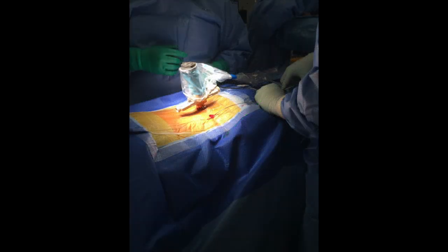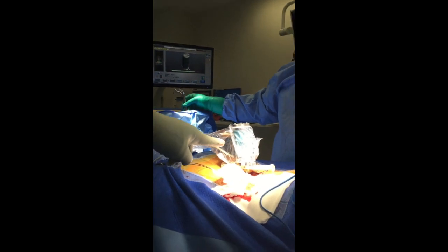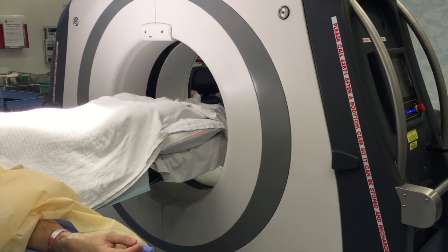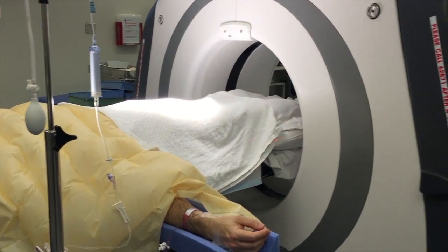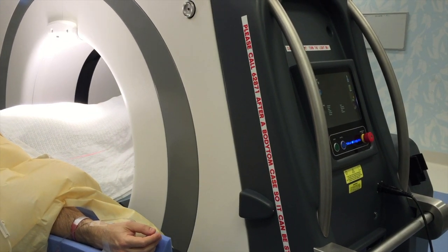Stage two was to use the robot shown here to percutaneously put the rods and screws in to fix her. All of this was done using neuromonitoring and intraoperative CT scanning at the very end to make sure that all the instrumentation was in the right location and in the right trajectory.